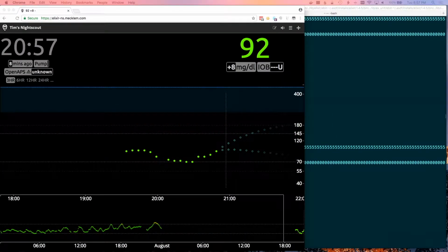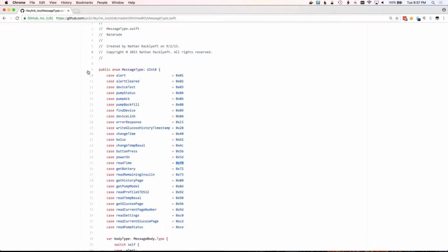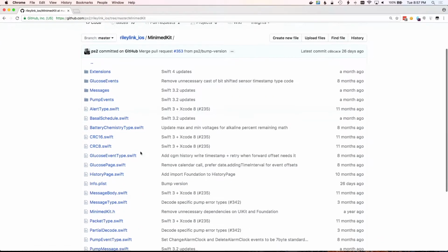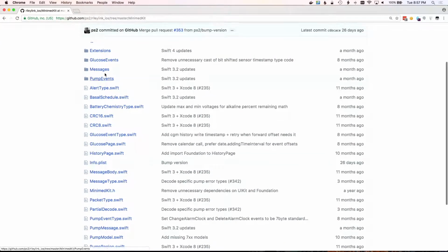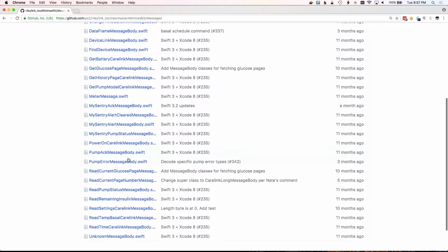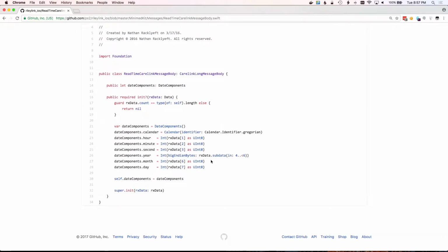So I'm going to pull up this message reference again really quick and just see what other people have done, because it seems pretty gnarly. So the hour looks like the 2nd byte. The minute is the 3rd. The second is the 4th.